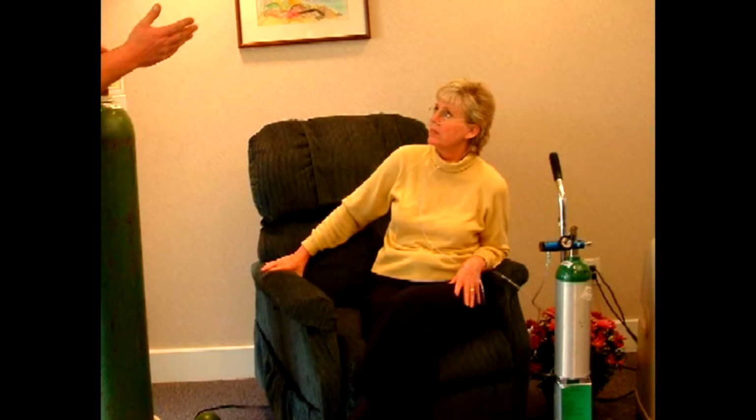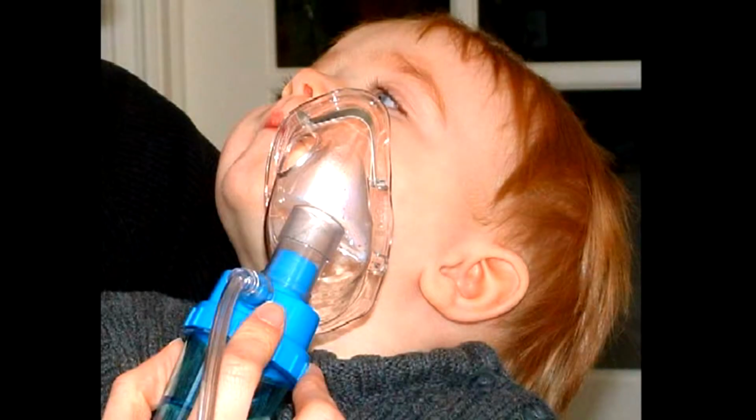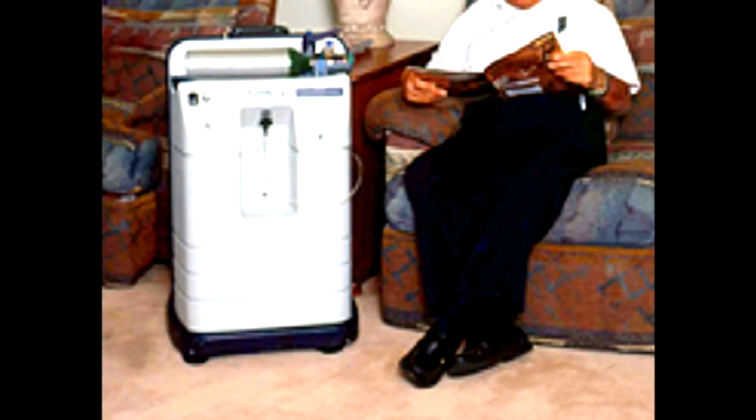At home, the patient education is pretty important because once you leave the home, the patient is responsible for the treatment. So you want to make sure that they understand completely what they're supposed to be doing with what piece of equipment. And monitoring the patient is important as well because some patients are compliant, others are not so compliant. You go from one extreme to the other where certain patients think more is better, so if they're on 2 liters they're going to crank it up to 4. And other patients, they don't use their oxygen for 3 or 4 days.